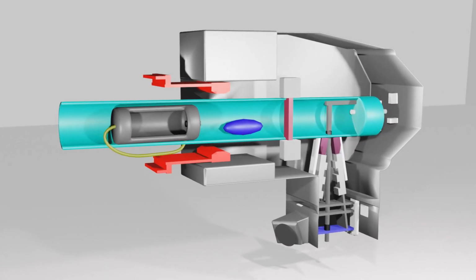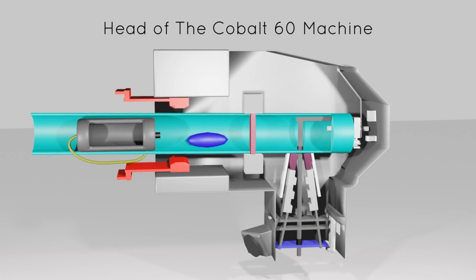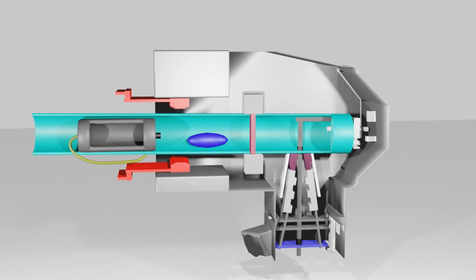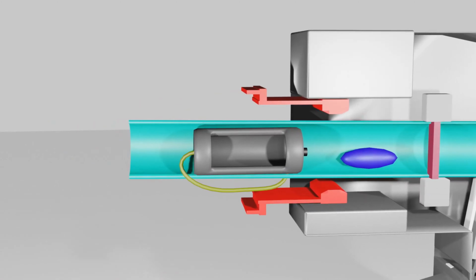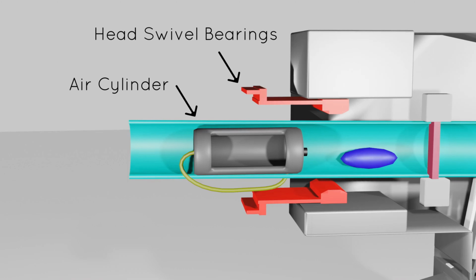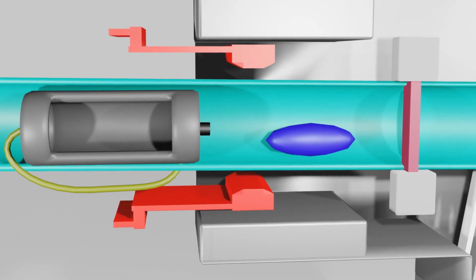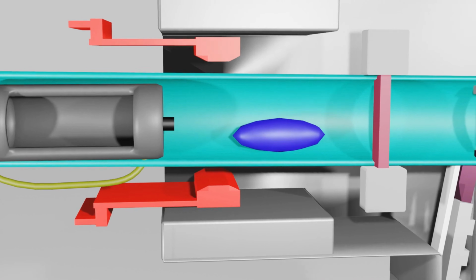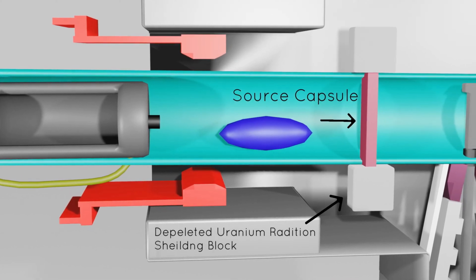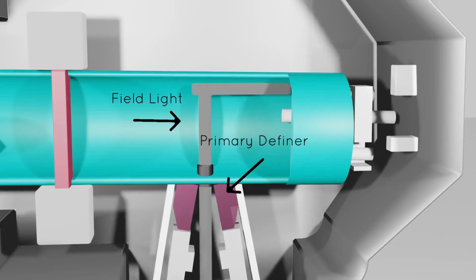The simulation time for each calculation point is approximately 1 to 2 hours on a computer platform of PC 1700 MHz. The point detector technique usually consumes a lot of computer time, but also achieves a better precision. A default cross-section library is used for photon tally, and the code reads the cross-section automatically from the photon cross-section library, MCPLIB22. The cobalt-60 source emits 2 photons per disintegration with energies of 1.333 and 1.17 MeV.